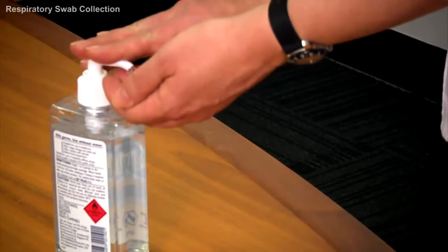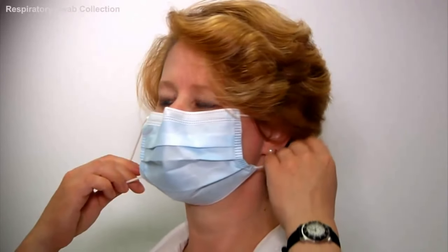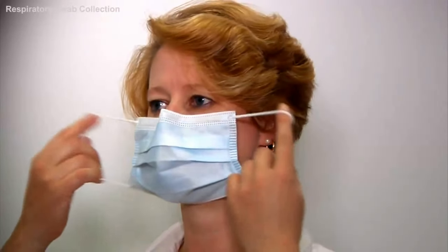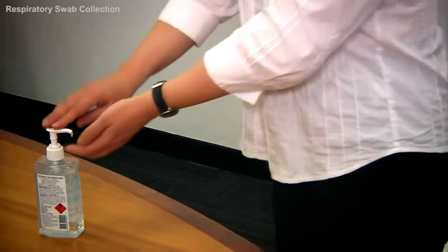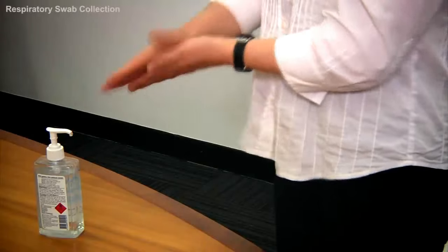Then wash your hands. Finally, remove the mask with clean hands by pulling it away from the face, ensuring the top and outside of the mask make no contact with your eyes or nostrils. Then perform hand hygiene. Finally, arrange for transport of your specimen to the laboratory.